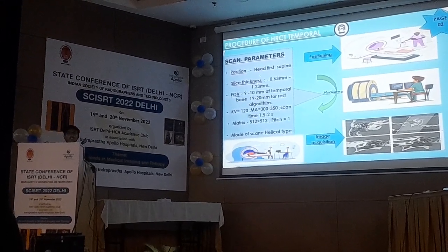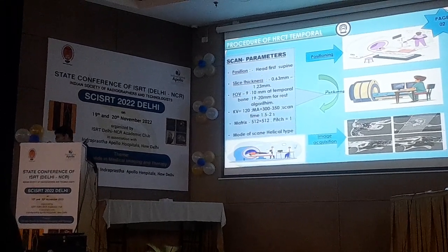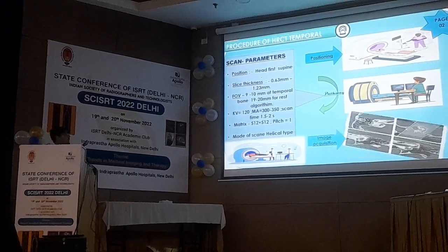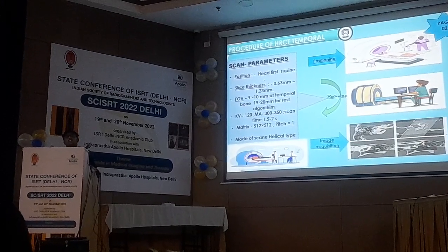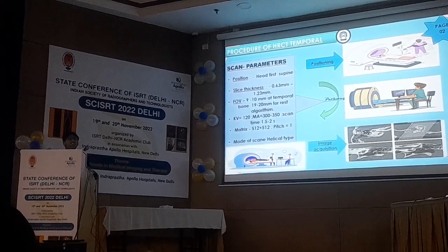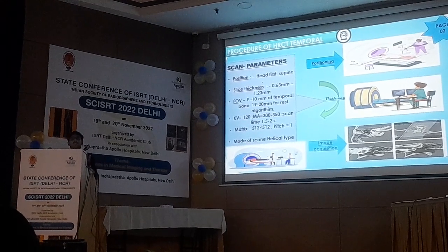So this is not at all the entire case when we are going for this. It is not only to get the acquisition or only to get the reading out of the axial slices. Previously, when reformats or three planar reconstruction were not there, when we were using dual slices, single slices, volume viewer reformatting was not there.